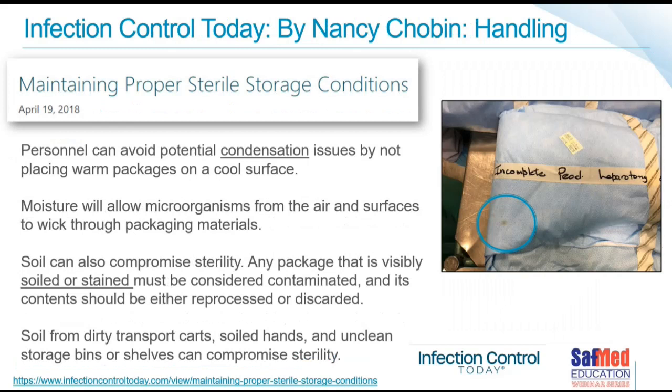Touching a little bit on handling over here, personnel can avoid potential condensation issues by not placing warm packaging on cool surfaces. Moisture will allow microorganisms from the air and surfaces to wick through the packaging materials. Soil can also compromise sterility. Any packaging that is visibly soiled or stained must be considered contaminated, and its contents should be either reprocessed or discarded.